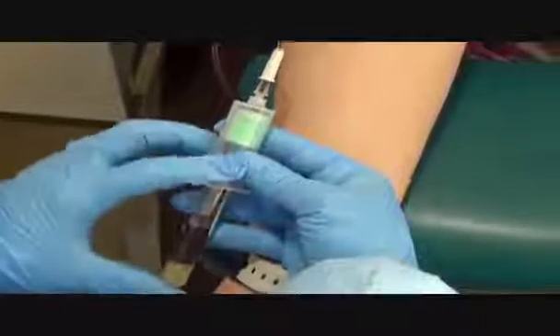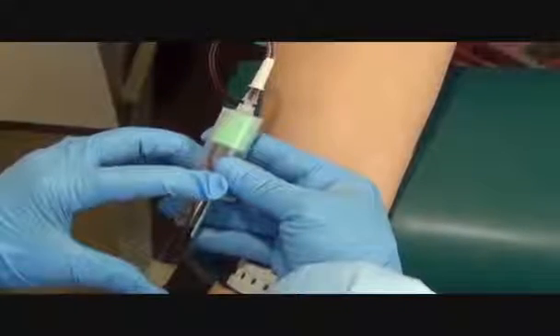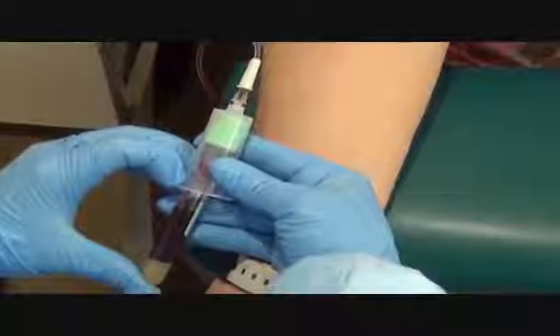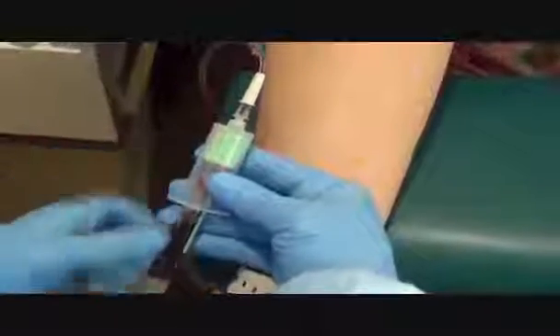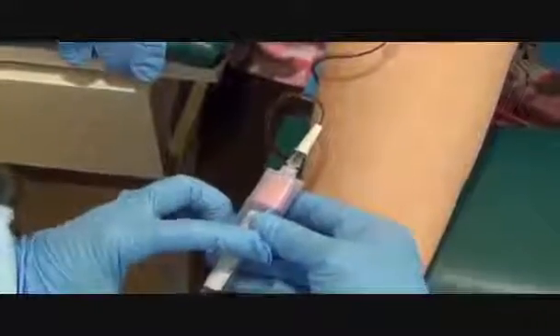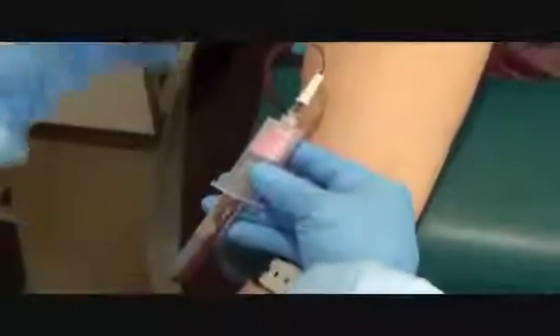The butterflies are smaller, so the flow is going to be slower. I just have to be patient with it. Are you doing okay? Yeah. The entire time I'm drawing blood, I want to make sure I'm aware of my tubing so I'm not pulling too far back, because if I pull too far back, I can pull the needle out of the arm.